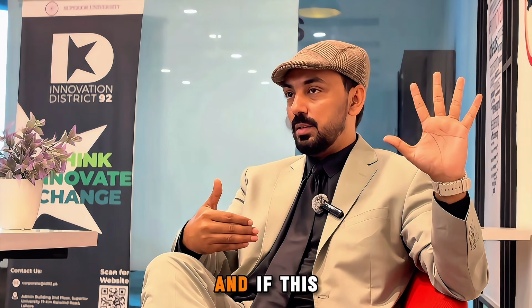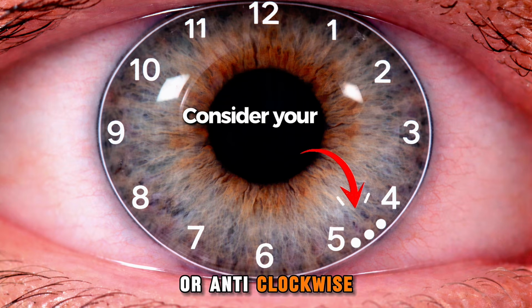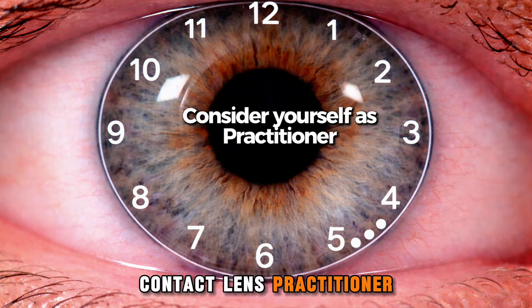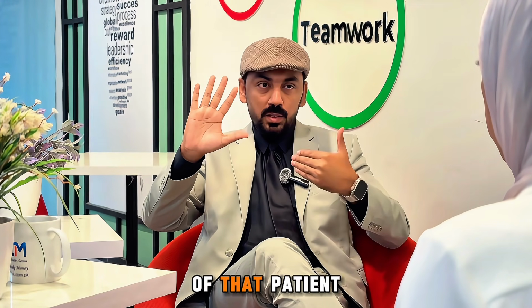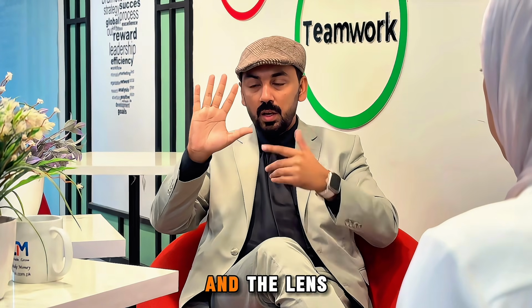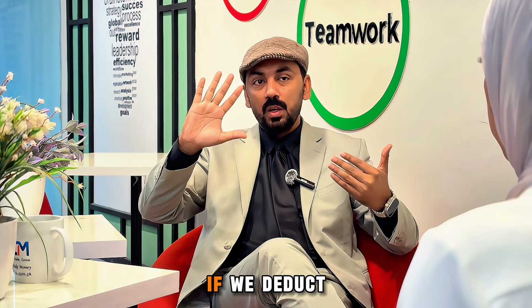So the new axis will be, if we add 10 degrees or 15 degrees to the 90, 100 or 105 axis. And if the contact lens is at the 6 o'clock normal position, and it rotates towards the right side or anti-clockwise with respect to the practitioner, we will subtract the axis. For example, the axis of that patient is 180 degrees, and the lens is moving towards the right side. It means we have to subtract from the 180 degrees. So the new axis will be, if we subtract 10 or 15 degrees from 180, 170 or 165 axis.